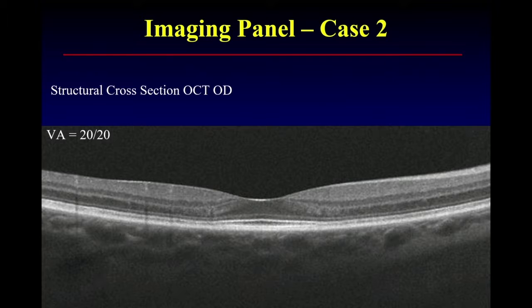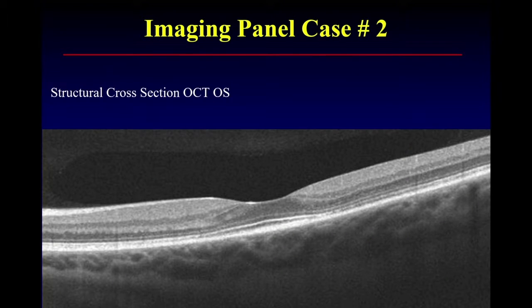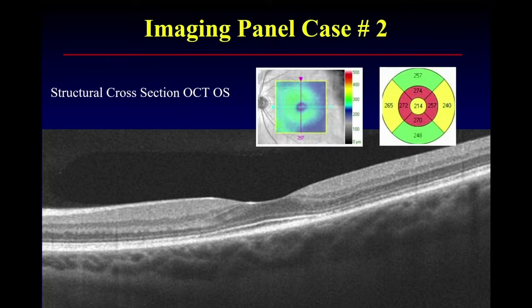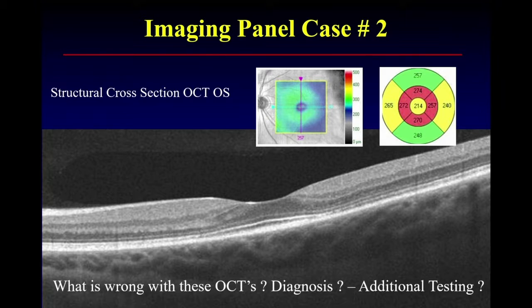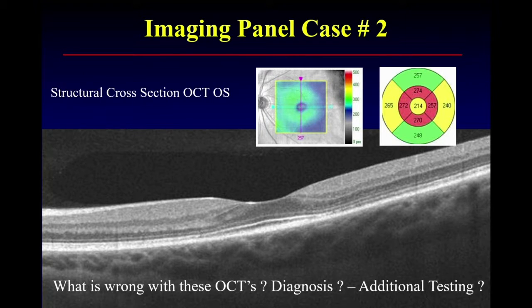Sun, could you take a look at this OCT of the right eye? I'm going to show you the left eye as well, and you have the advantage of seeing the macular scans and thickness maps. So, what's wrong with these OCTs? I see some increased reflectivity on the nerve fiber layer and the plexiform layer, and then there's some space expansion under the outer retinal layer. I don't see any thickness change on the thickness map.